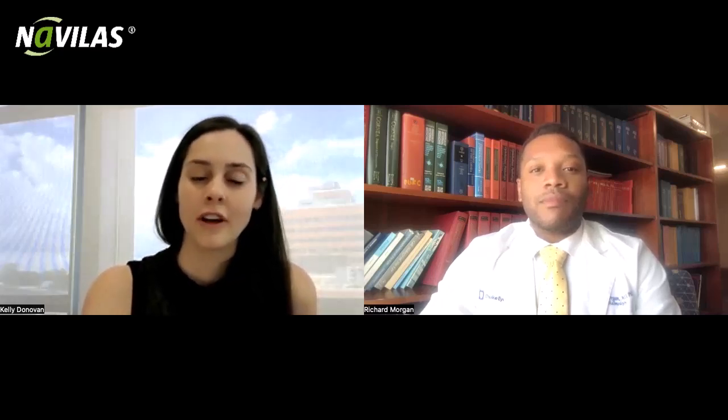What has been your experience coming up with little tips and tricks? So I think it can be hard to balance holding the lens. You're holding up your lens, you got your little elbow rest, and then you're also navigating the Navilas screen to your right. When you're first starting out, I think it's pretty similar to doing a gonioscopic exam. Kind of just the feeling of almost being at a slit lamp and holding up that lens and keeping it steady against the patient's eye. So I think practicing your gonio exam could double as practicing for getting ready to use the Navilas.